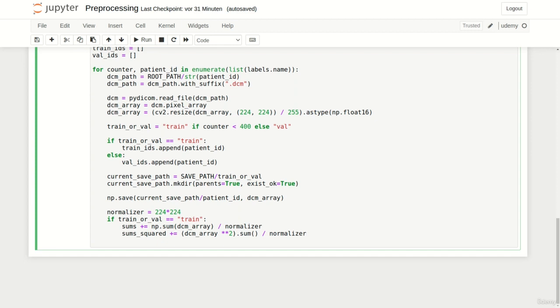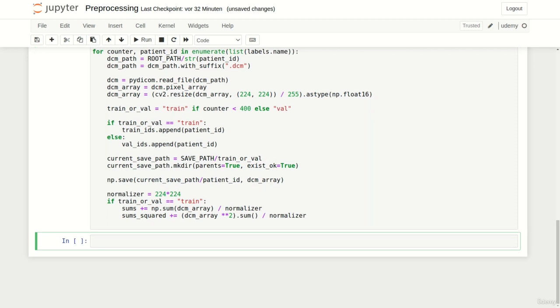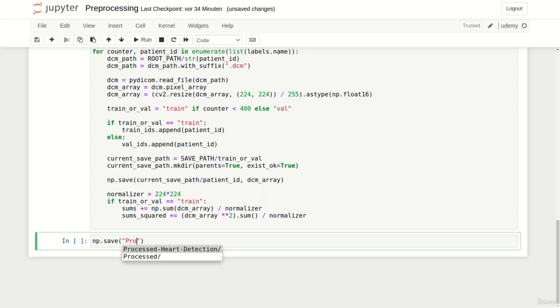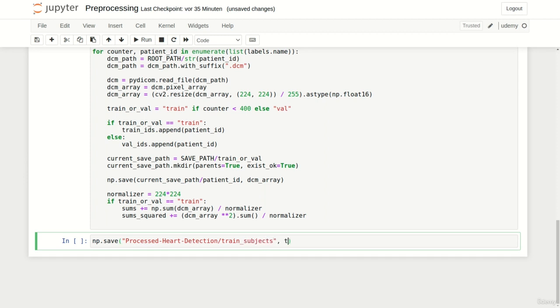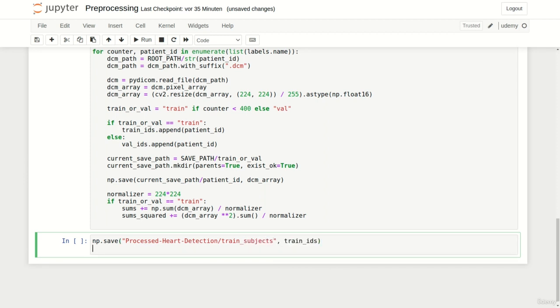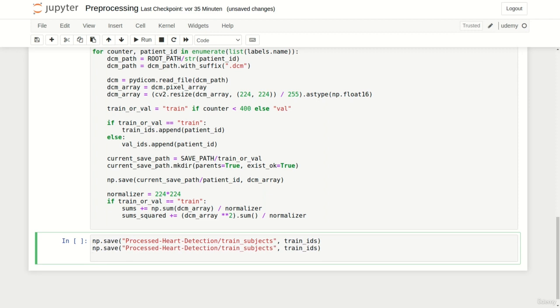Cool. Our preprocessing loop is complete. It should only take a few seconds to store all preprocessed images. To enable our dataset later to distinguish between train and validation subjects we simply store those two lists. At first we can save our train IDs in the processed heart detection directory as a file called train_subjects. We simply repeat this procedure for the validation subject by replacing train by val.